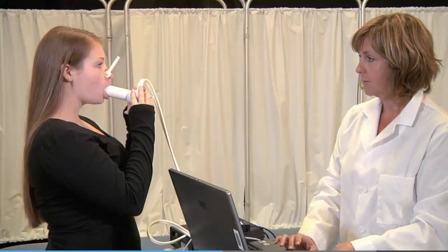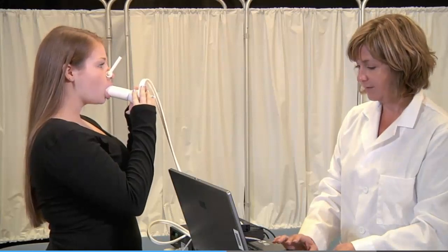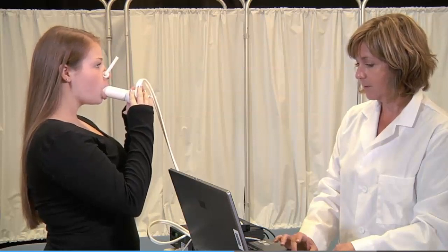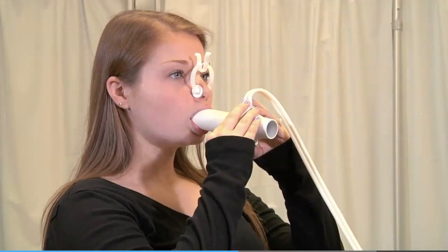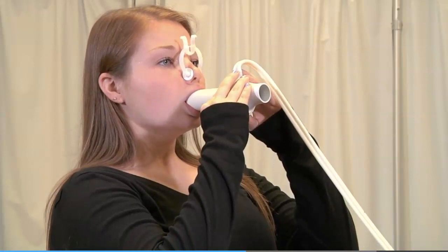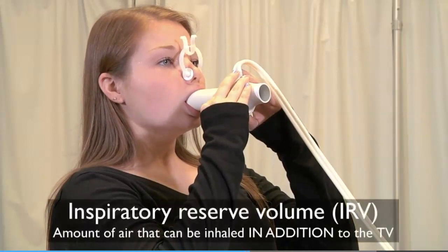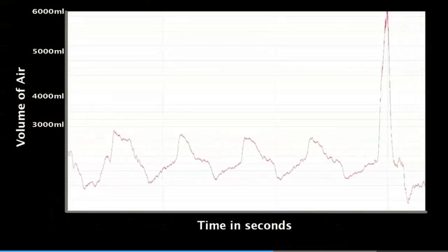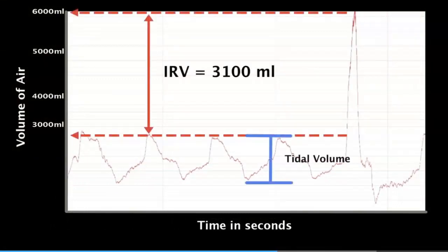The tidal volume does not represent all of the air that can be moved in and out of the lungs. Additional air can be inhaled and exhaled. To measure the additional volume of air that can be inhaled, breathe in as much air as you can through the spirometer. This additional volume of air beyond the tidal volume is called the Inspiratory Reserve Volume, or the IRV, and is typically about 3,100 milliliters. To analyze the results, read the volume of air moved on the y-axis.